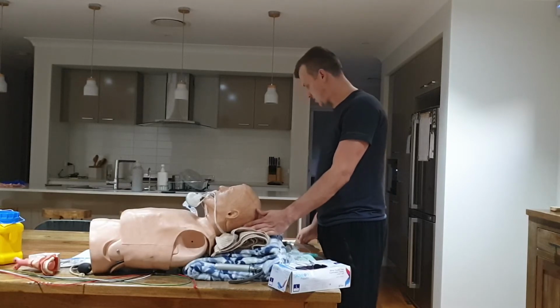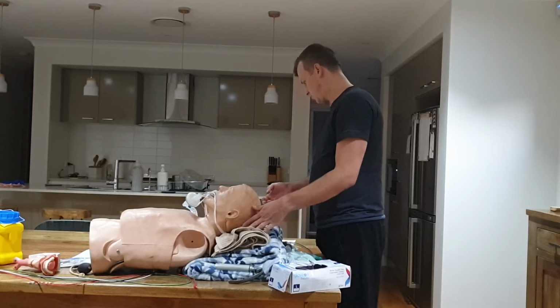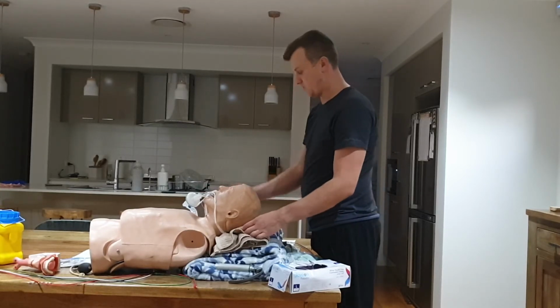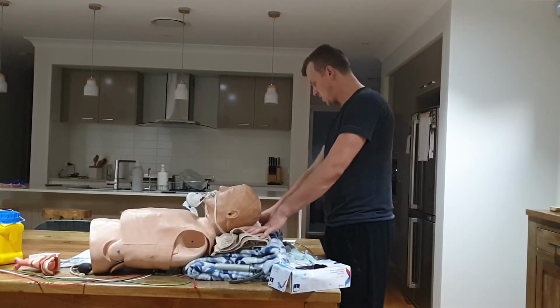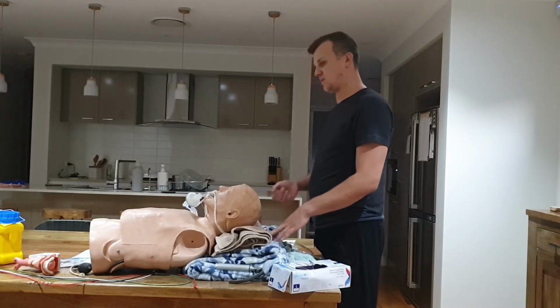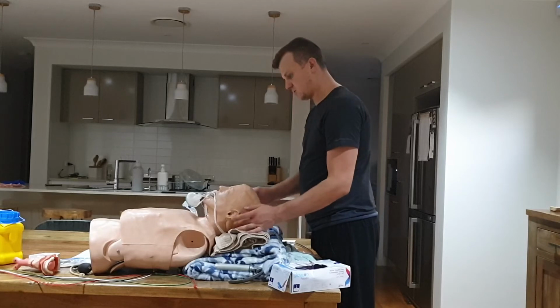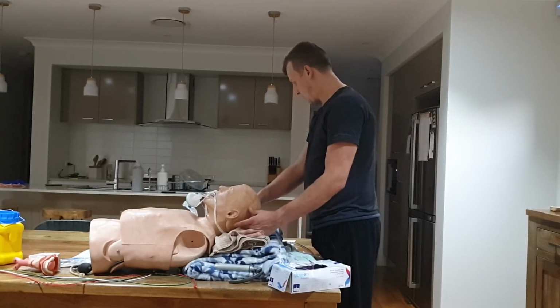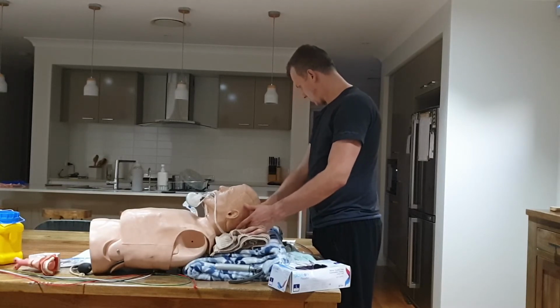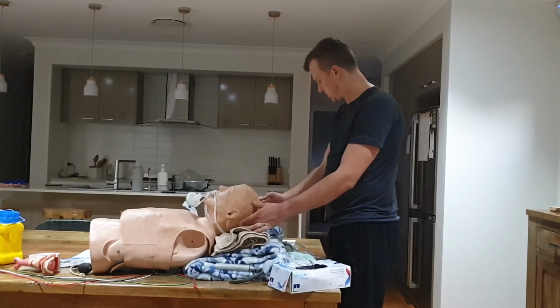Now just to talk about CO2. The indications for using CO2 may be cardiopulmonary resuscitation, or when you have a return of spontaneous circulation. If you want to confirm the intubation, as we did just then, or during procedures which require sedation, to monitor their ventilation, as they may be hypoventilating or hyperventilating. Also, it's useful in monitoring patients with raised intracranial pressure, patients with pulmonary diseases, pulmonary embolisms, or metabolic disorders such as metabolic acidosis.